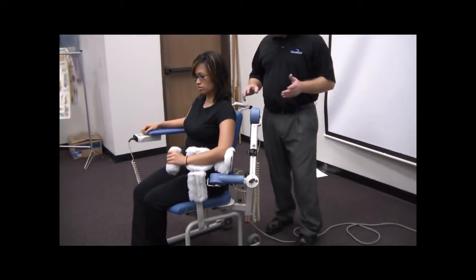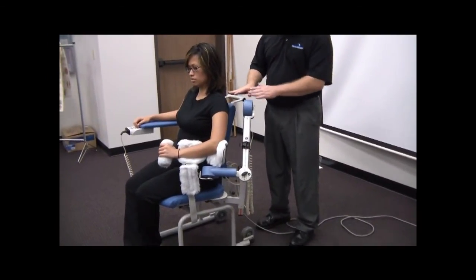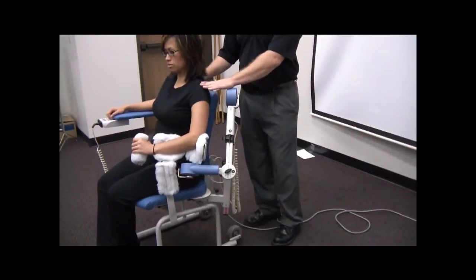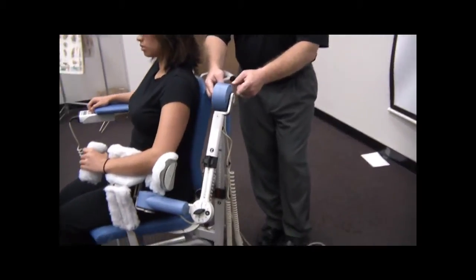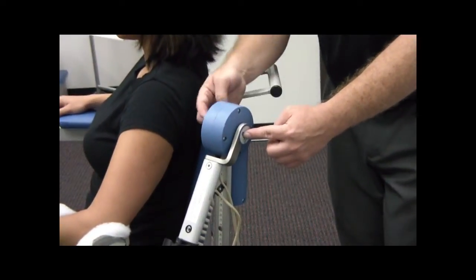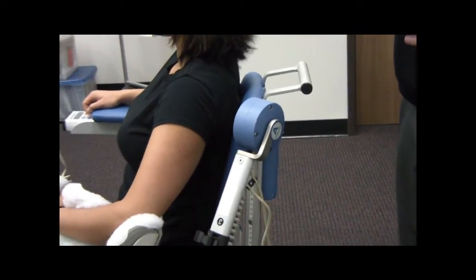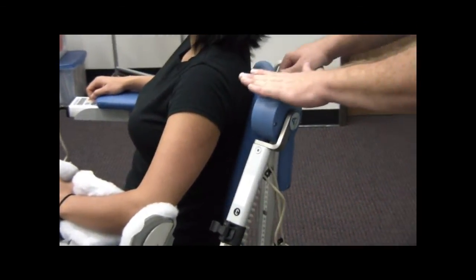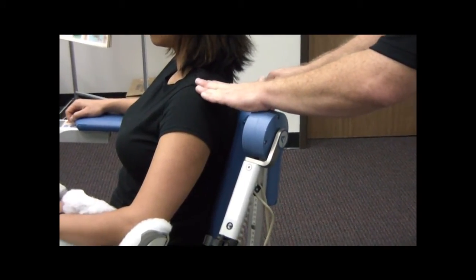Now, number 2 is the most important setting on the machine, and it is going to be relative to the patient's height. What we want to do is line up the pivot point of the motor. Basically, the pivot point of the motor is where the number A is on the back here. We want to line up the pivot point on the motor with the shoulder socket, or the pivot point on the shoulder. Now, to do that, a couple different things need to come together.